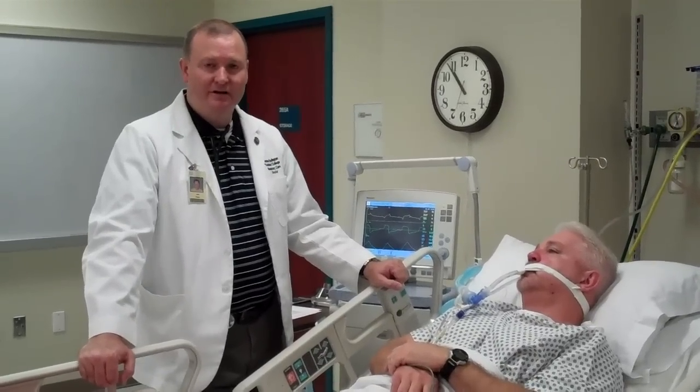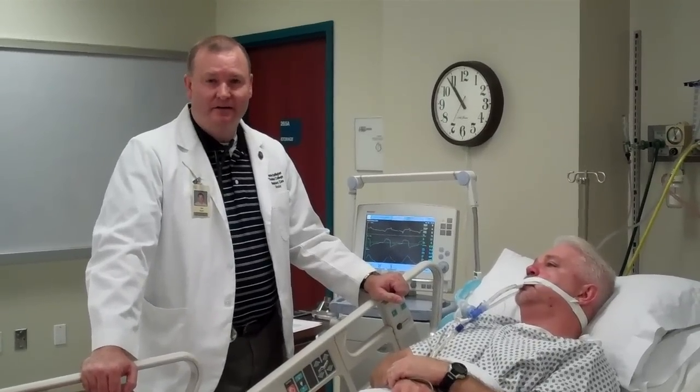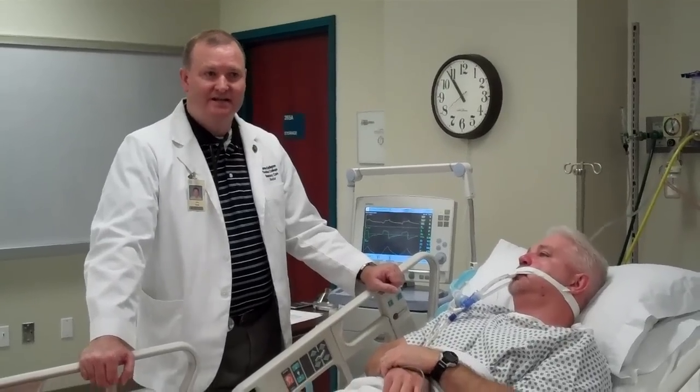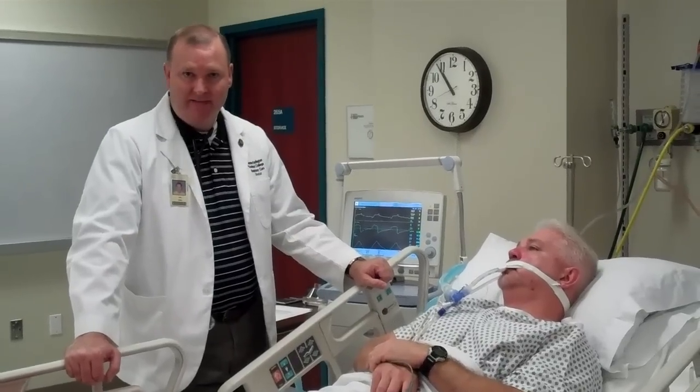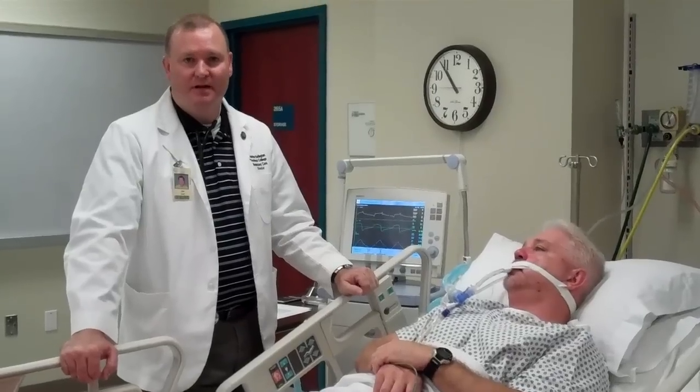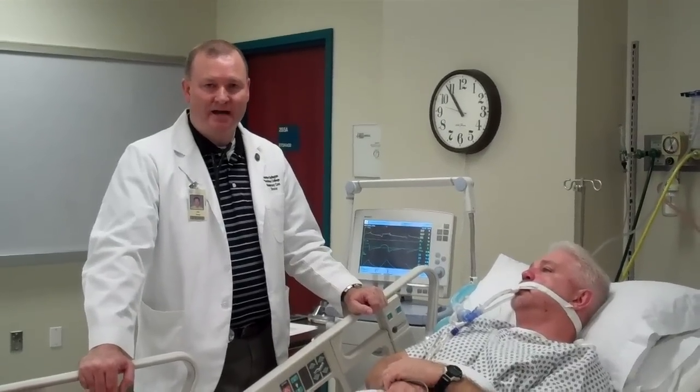Again, you're not going to be able to measure the exact amount of pressure that the patient is doing, but you will be able to at least get an indication that it's greater than 20, and that's our bottom line for weaning criteria. You want the patient to be able to pull in at least a minus 20.